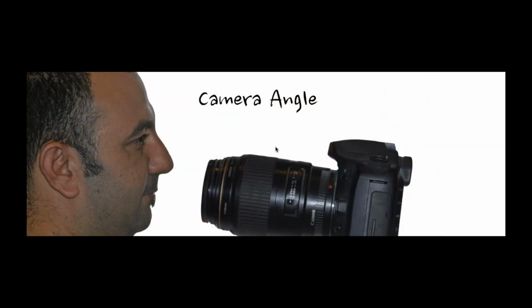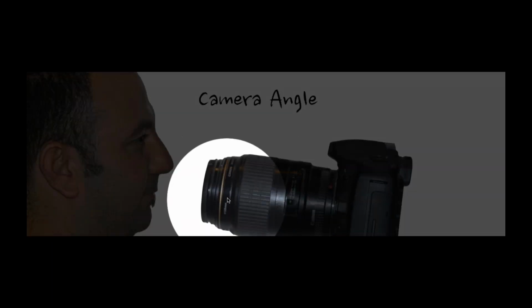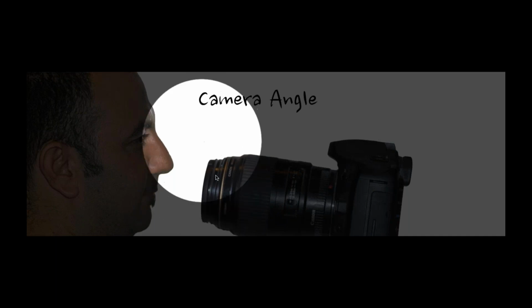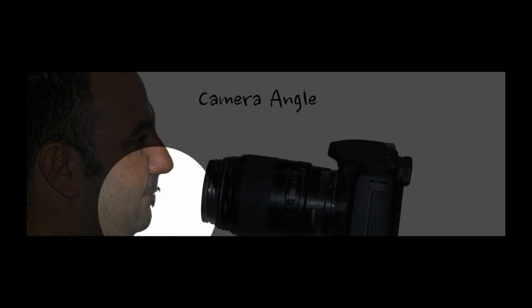The goal for you is very simple. This is my friend Sasha from Harvest Dental. The goal for you is very simple. I want the flat of the camera to be even to the flat of the lip, or the flat of the facial of the teeth.